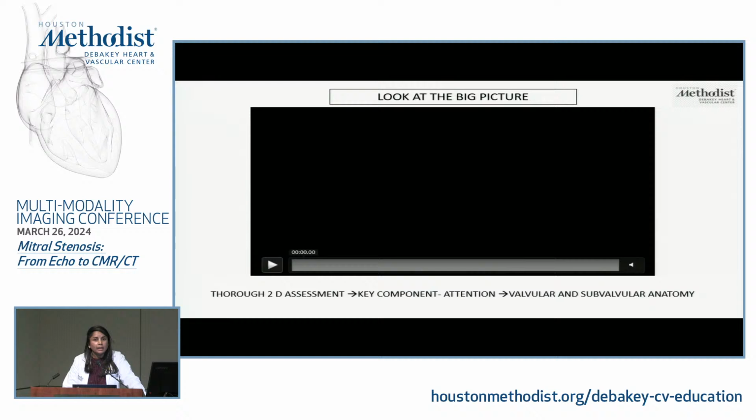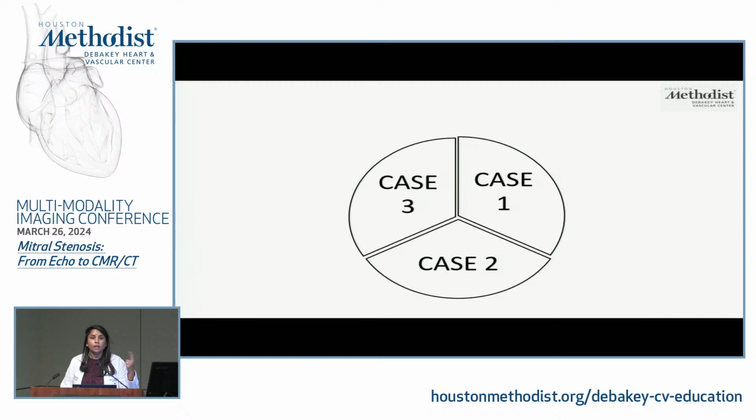Unfortunately, it's not playing, but it's a little bit of a video about how we need to look at the big picture, right? If you try to look at the micro details, sometimes you can actually miss the bigger picture. So I really wanted to reiterate the fact that you should look at the big picture, look at the RV. When you're trying to assess mitral stenosis, don't just focus on the mitral valve itself. So let's look at a couple of quick case examples here.